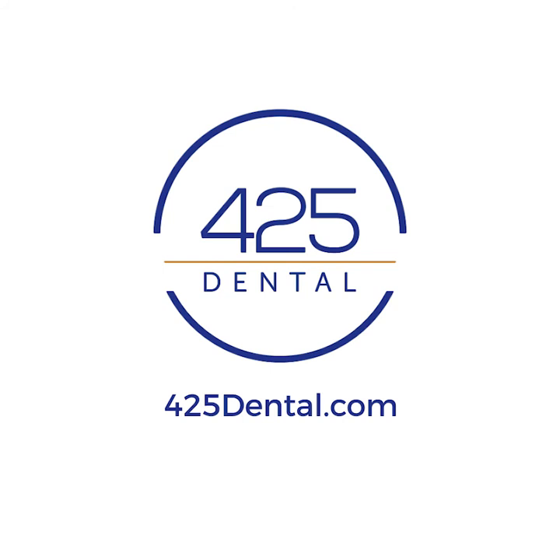For general aligner cleaning after meals, you can use your toothbrush and toothpaste or even dish soap. There are 3 sample packs of cleaning crystals provided in your Invisalign box. When you run out of these, you can definitely purchase Clean Night on Amazon.com or buy any brand of denture cleaner from a drugstore. These products help pull stain and bacteria for a deeper clean. For a more natural approach, you can use a 1:10 ratio of white vinegar and water dilution.